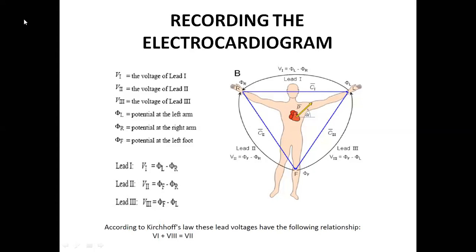Photography means the process of taking photos with a camera or mobile. What you get is called a photograph. Similarly, the process of taking the record of the action potentials and resting potentials of the heart is called electrocardiography.